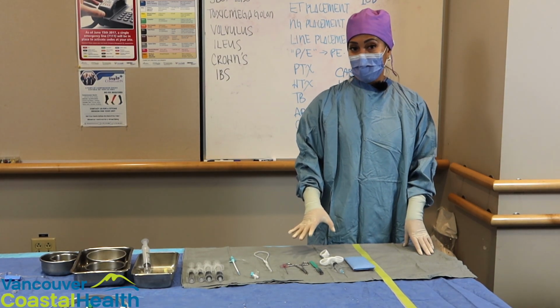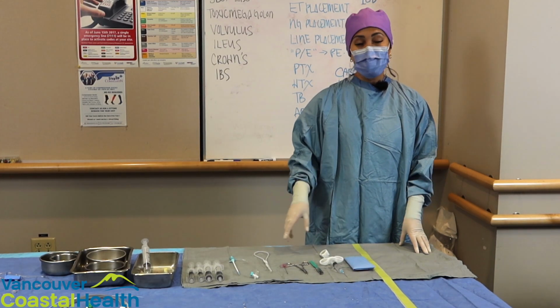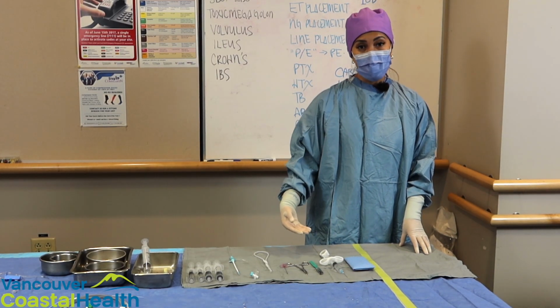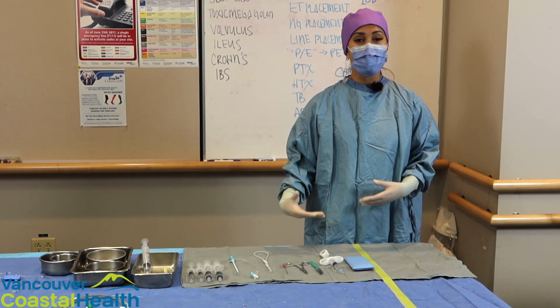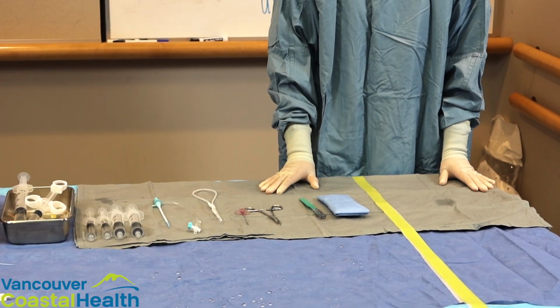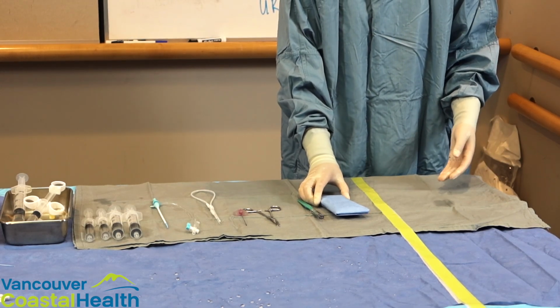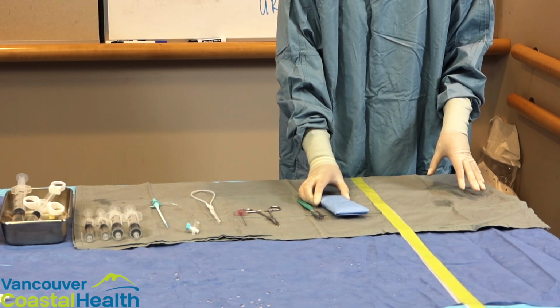Physicians can access by themselves, so I'm going to demonstrate as if I was working by myself, and then I'm going to interject at points and say where you as a scrub assistant might be helping in a case if you were scrubbed beside. Okay, let's begin. This is how we gain access using Seldinger technique, whether that be radial, femoral, IJ, the technique is the same no matter the part of the body.